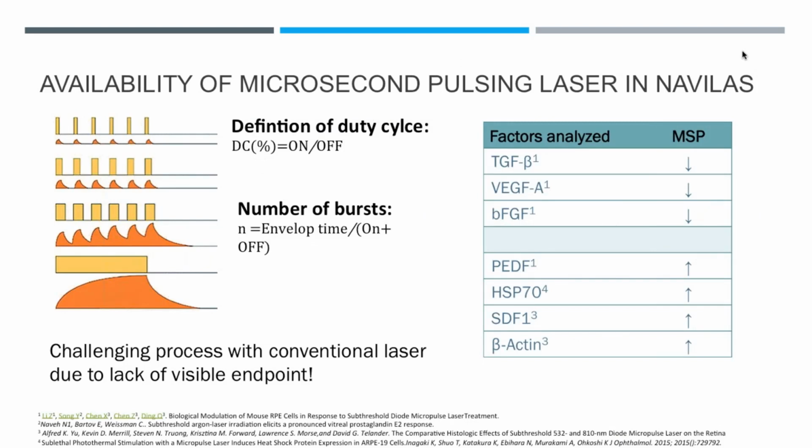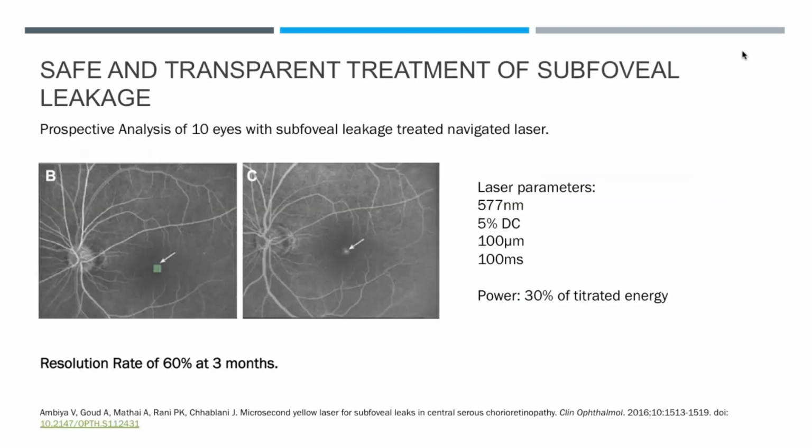What else can we do with navigation? We can use this for microsecond pulse photocoagulation, or photostimulation, I should say, which is another mode of laser delivery that has been gaining popularity, that can be combined with navigation, which we believe accentuates its strength.